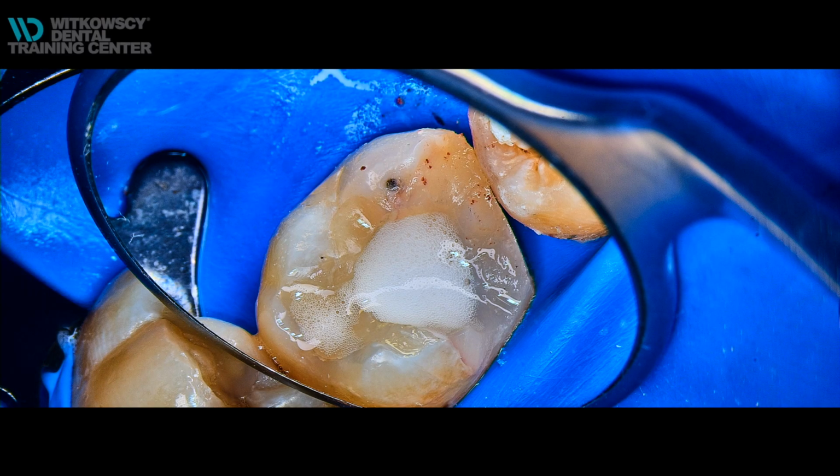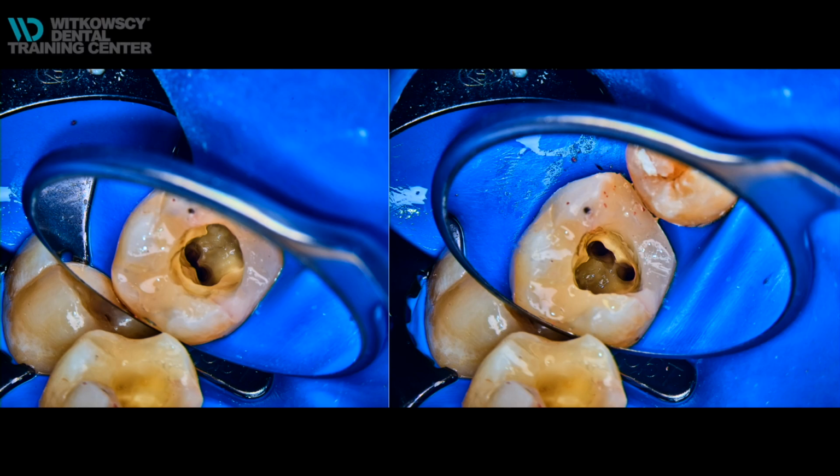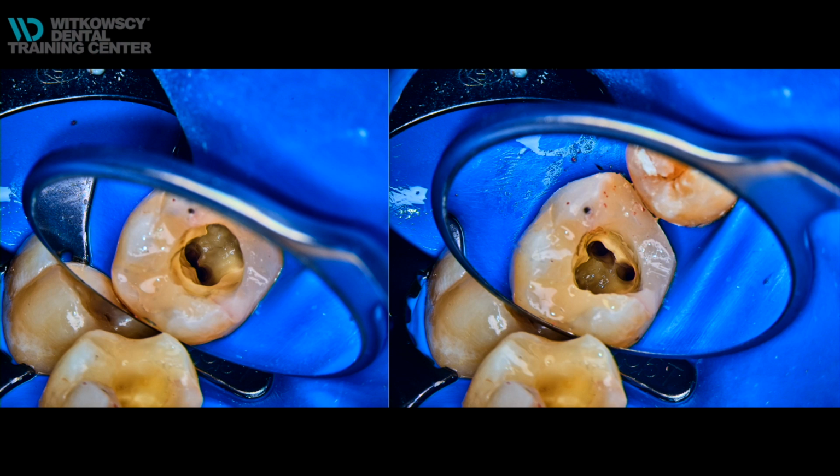So when I prepped and irrigated, I reached my goal and I thought I had reached the apical zone. Unfortunately, the apical zone was not the one that I wanted to get, but the wrong one. Let me show you why. In the mesial part, I finished with 2, and then I had 2 in the distal part. And of course, my shaping protocol was not quite correct in this situation.